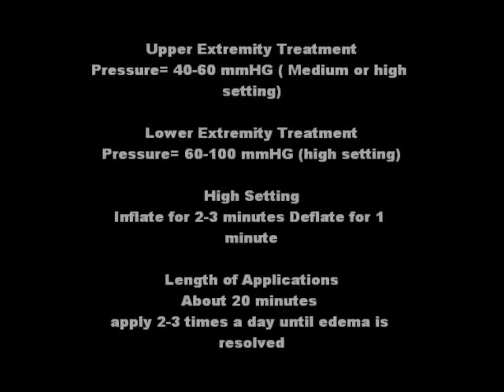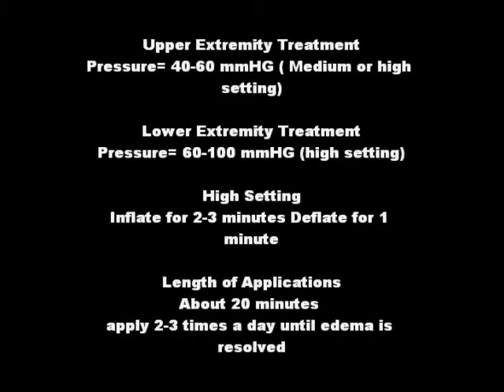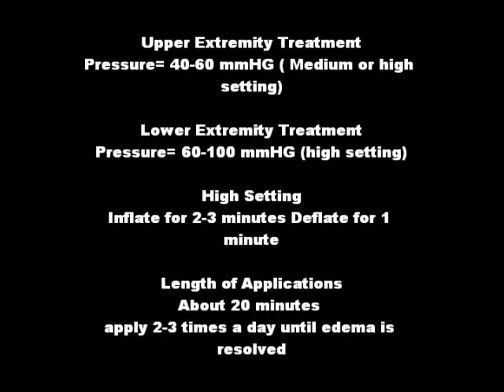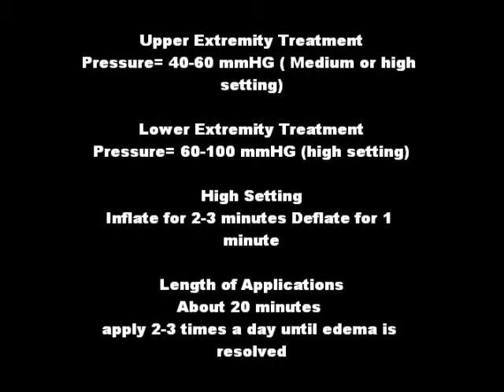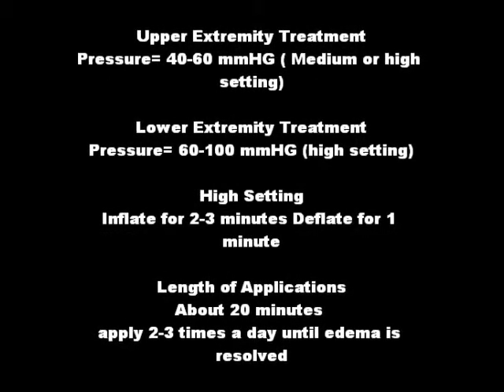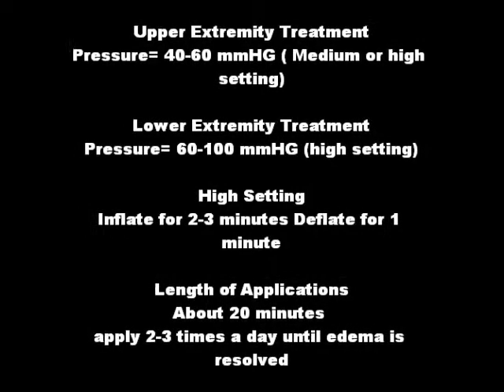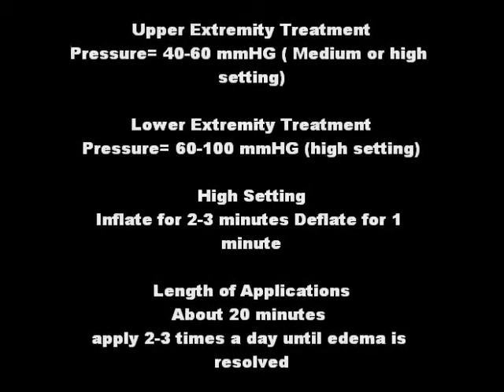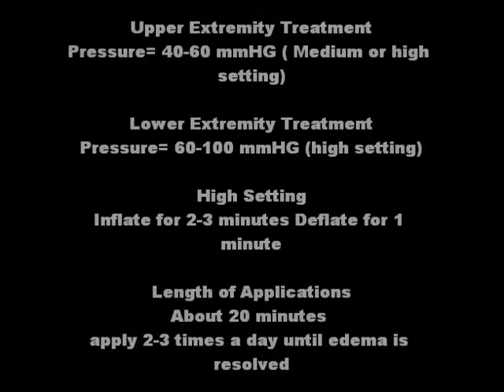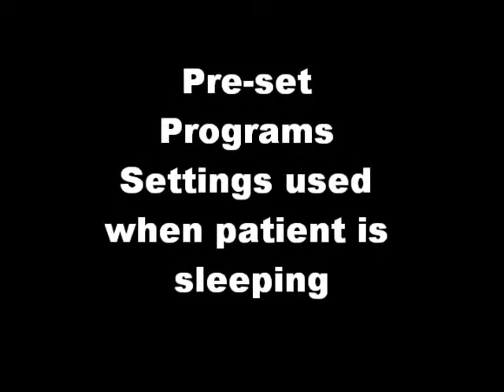And for a lower extremity treatment, the desired pressure should be between 60 and 100 millimeters of mercury, which is the high pressure setting on the unit. With the high pressure setting, the unit will inflate for 2 to 3 minutes and deflate for 1 minute. Once the desired treatment parameters are set, including pressure, temperature, and time, push the play button to begin treatment. The length of application should be about 20 minutes and can be applied 2 to 3 times per day until edema is resolved. The GameReady unit also has the ability to use different previously set treatment programs.